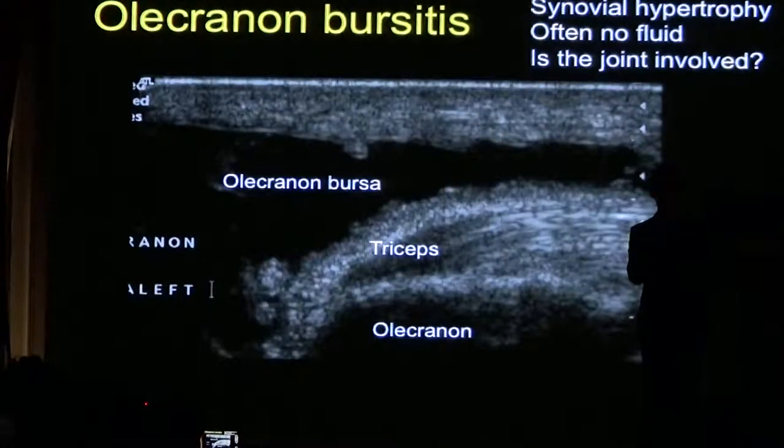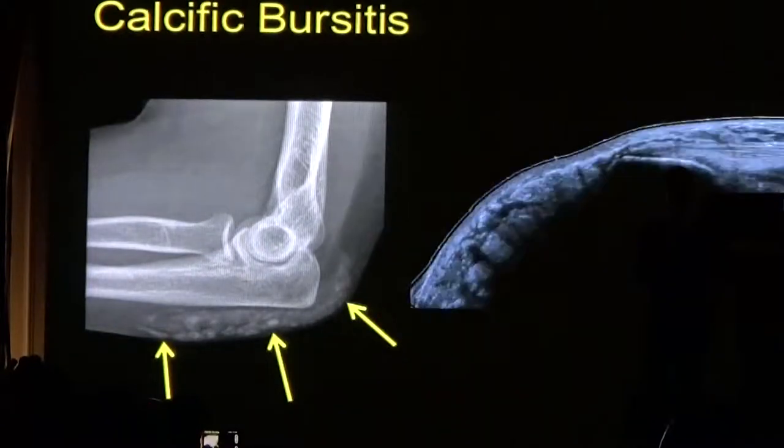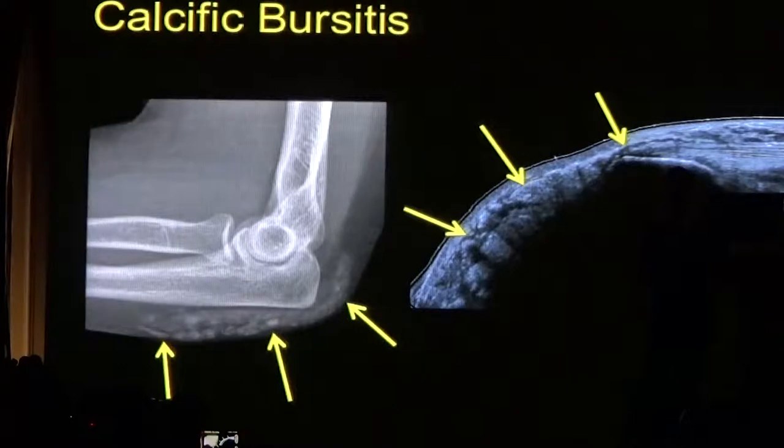This is an example of a bursa that is fluid-filled overlying the triceps and olecranon. Rarely, in conditions such as gout, you can have calcification in the bursa. In this patient, when we did the ultrasound examination, we noticed there was a lot of echogenic material. An X-ray was performed, which confirmed the presence of calcification.